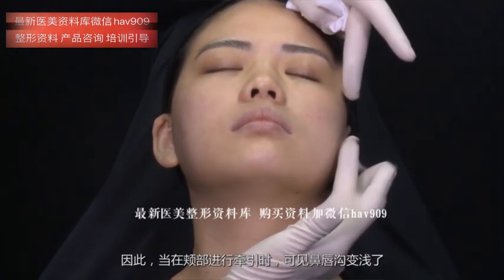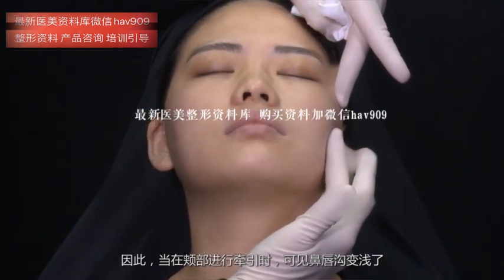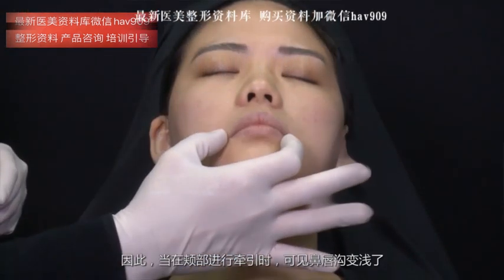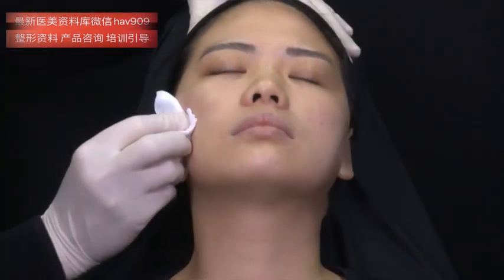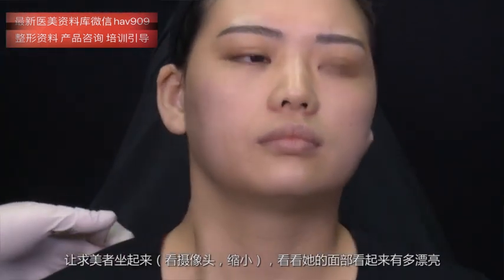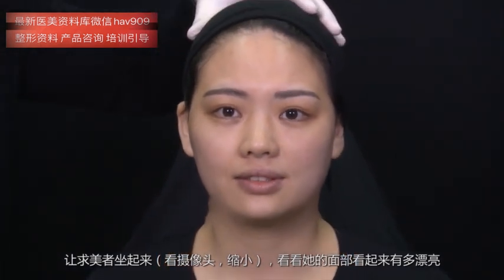So when I make a traction in the cheek, the nasolabial fold becomes less evident. Let's sit up the patient.